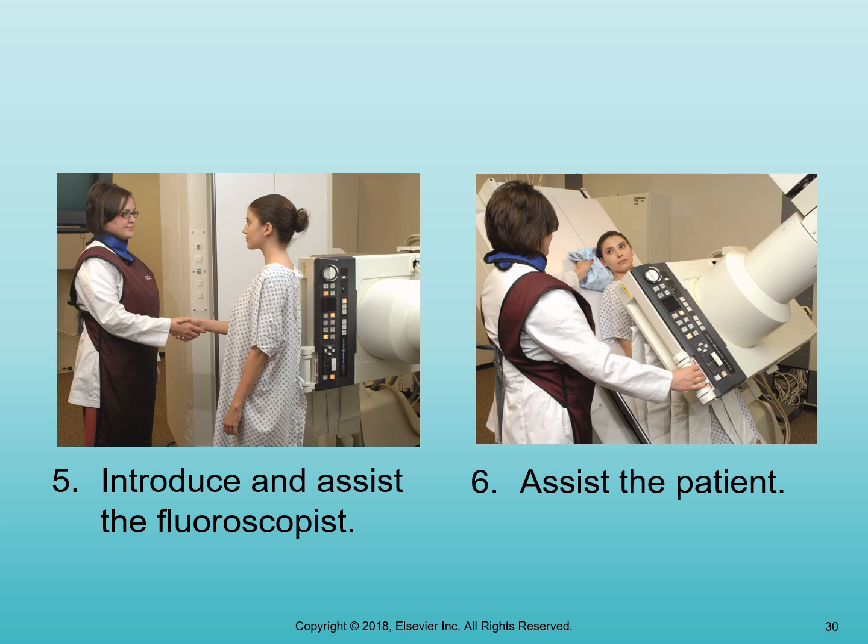Now, I know we jumped from that to introduce and assist the fluoroscopist, but remember in the other lecture, I mentioned that if we are doing a fluoro procedure, once we give the patient contrast media, we basically cannot undo that process until they eliminate the contrast.